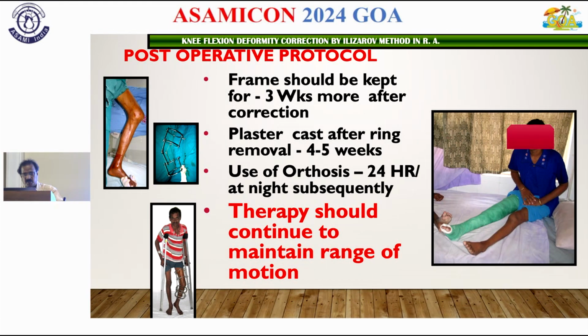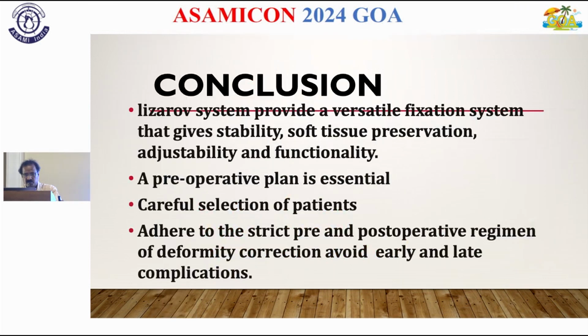So always after the frame removal, we do casting for some days. But always remember, therapy should continue during all phases of the treatment. To conclude, the Ilizarov system provides a versatile fixation system that gives stability, soft tissue preservation, adjustability, and functionality. A preoperative plan is essential. Careful selection of patients and adherence to a strict pre- and post-operative regimen of deformity correction avoids early and late complications.